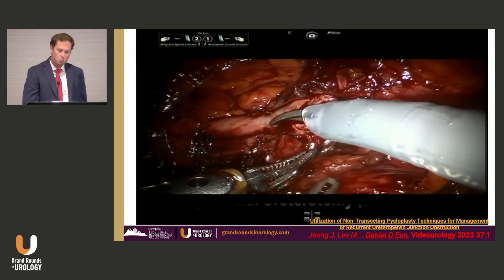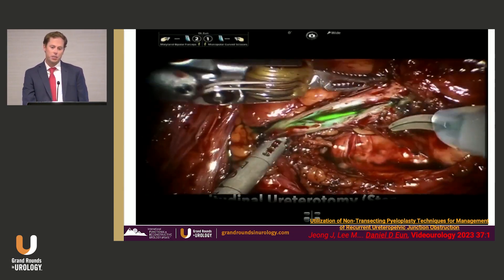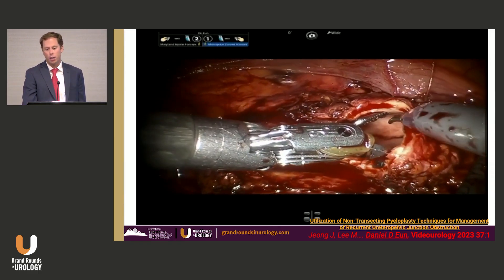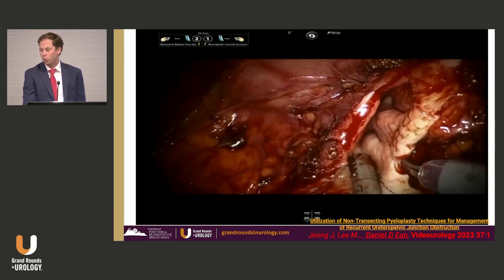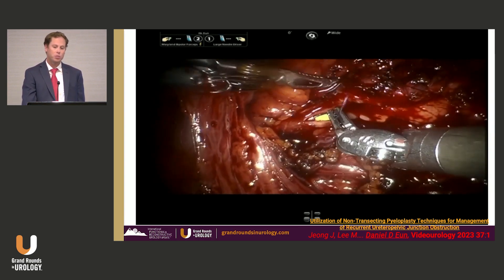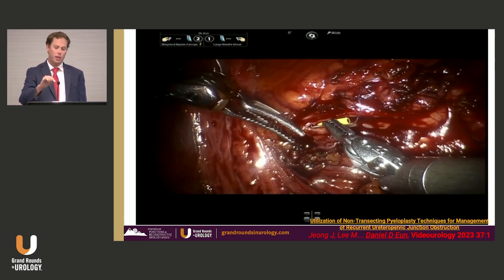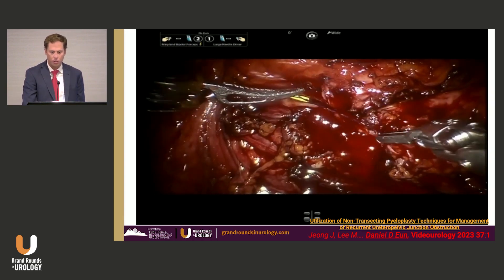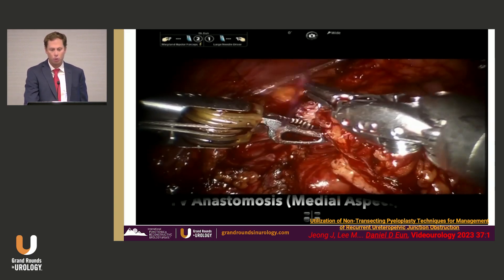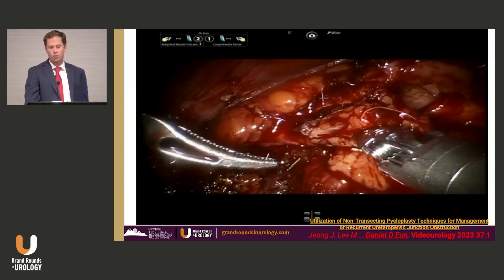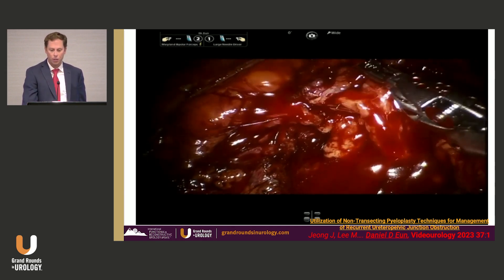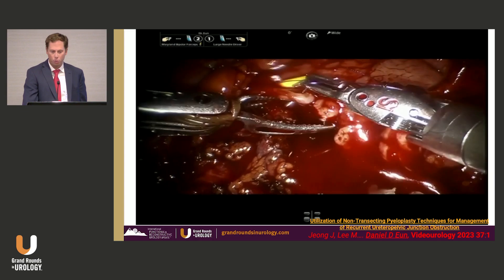This video is from Dan Oon, with his permission. He makes a long longitudinal incision down the ureter, and this is the top part of the Y incision on the renal pelvis. You take the vertex of that Y and bring it all the way down to the most distal portion of your longitudinal ureterotomy, creating the V — hence the name. Once you get that down, you basically just have a medial side and a lateral side to close. Place the stent before finishing the anastomosis, and it comes together as a fairly straightforward procedure.